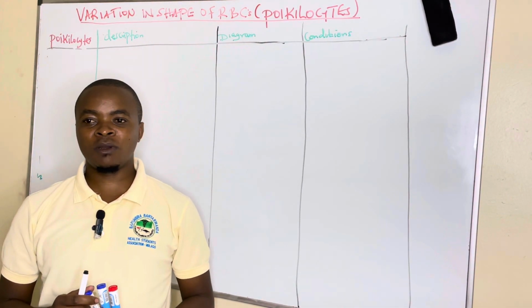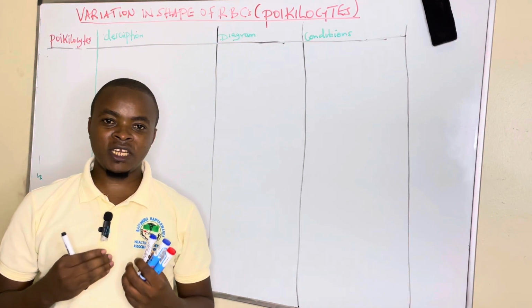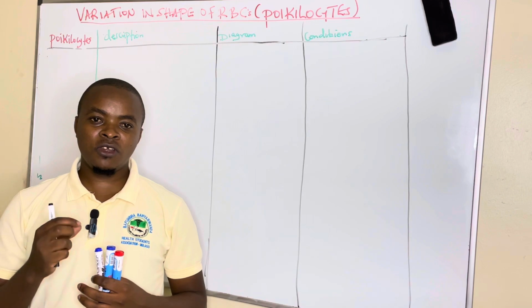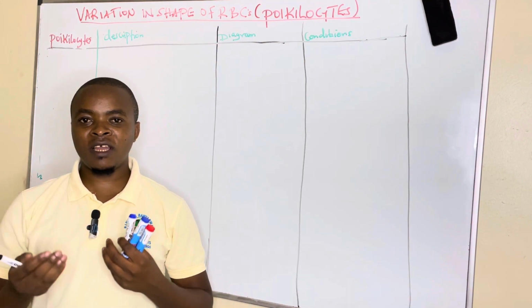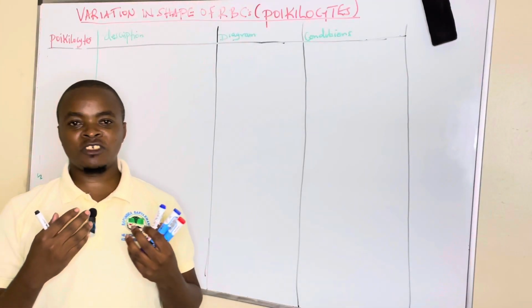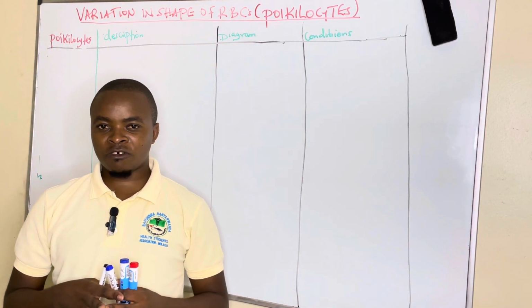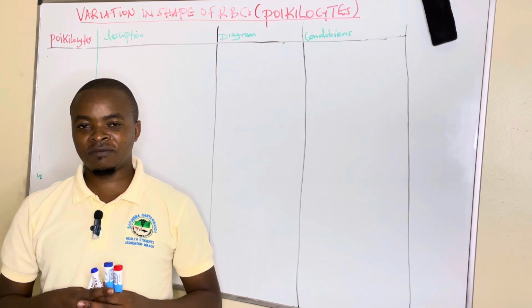Today we want to discuss different poikilocytes, what we are calling variation in shape. Poikilocytosis, under film comment, we know it as the variation in shape of red cells, whereby you find under the film comment different types of shapes varying from discoid to dacrocytes, those which are sickle-celled, and others, which you want to see in this video.